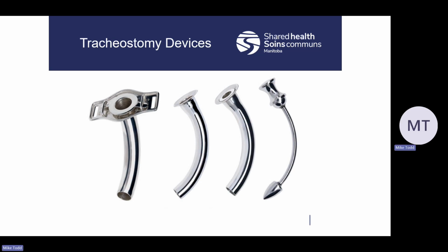Some actual tracheostomy devices themselves are a lot more common. You're seeing them more and more in the field now. And usually, again, long-term, they're used in the hospital. They're better for weaning patients off the ventilators in the ICU versus long-term endotracheal intubation. And it can just allow for greater functionality out of the hospital, and the patient can usually handle them by themselves at home.